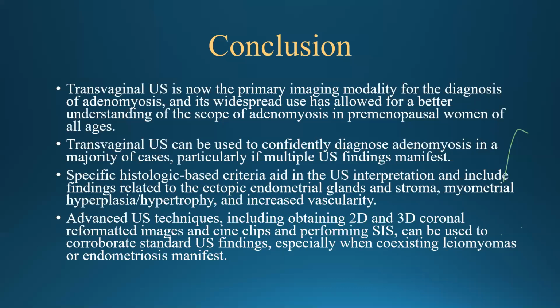And also performing saline infusion sonography, if you don't have the facility to do the 3D reconstructive images. All of this can be used to corroborate standard ultrasound findings, especially when we do have existing leiomyoma with the adenomyosis. As I mentioned, adenomyosis is sometimes a very challenging diagnosis in terms of its association with other similar conditions and with no differentiation from the clinical presentation of the patient.